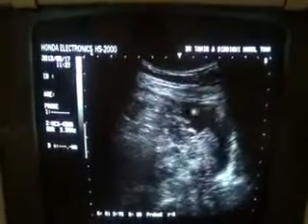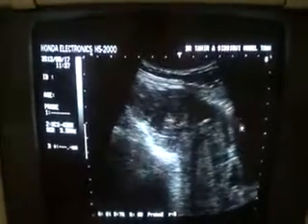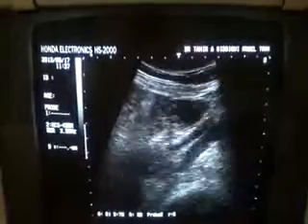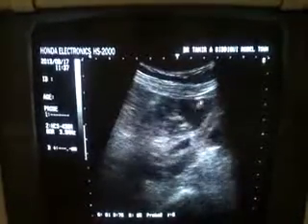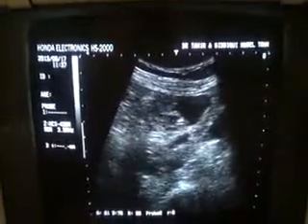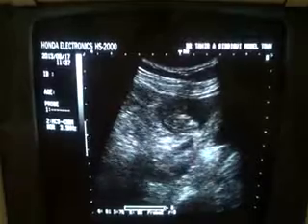This area you see is the urinary bladder, iliac vessels, right iliac vessels, the fluid, the bowels. So this is our case of the day. Thank you.